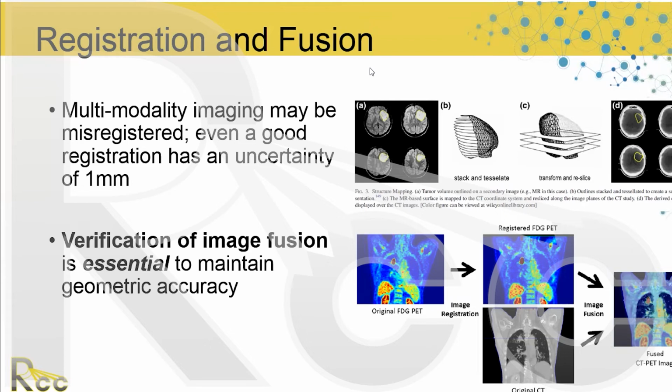Absolutely. And that's the thing: if this is a fuzzy point, then it's not you. We're the educators, so we'll work on explaining that in a clearer way. But Sarah was right, I was referring to contouring for the MIP. I agree completely with Ben: average is best with a 4D or with a cone beam CT for matching.